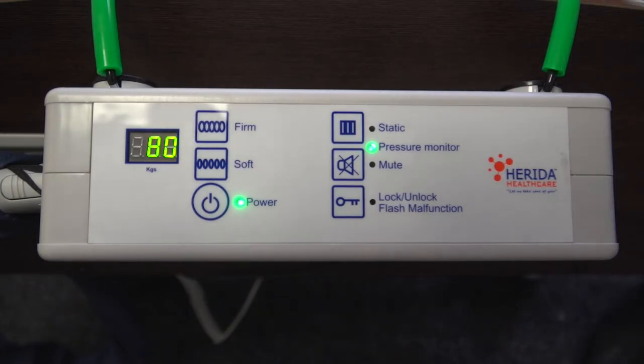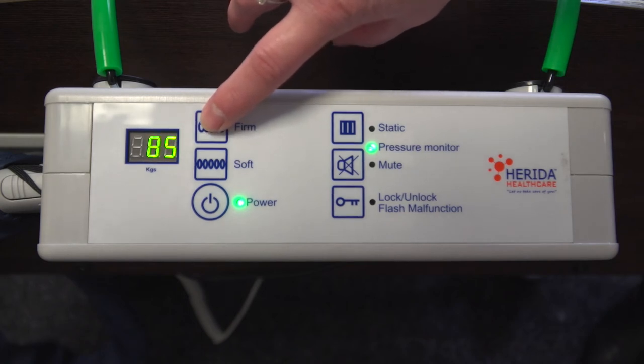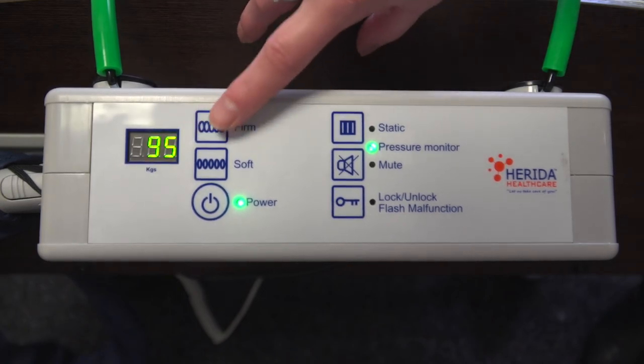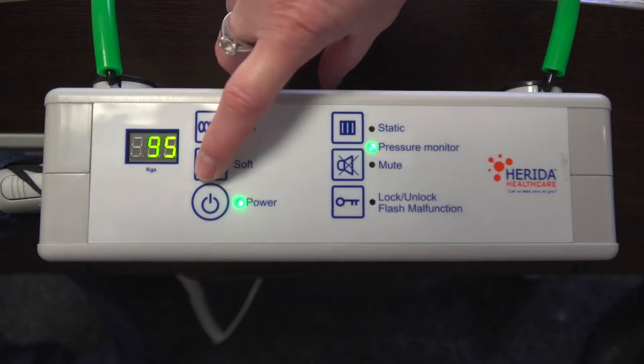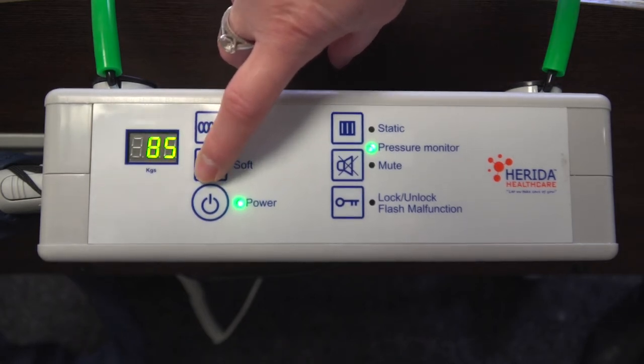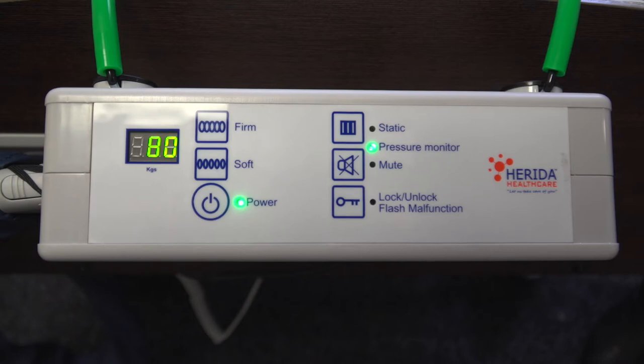If the patient's weight exceeds 80kg, we need to increase the pressure. To do this, we need to use the firm button. Pressing this button once will increase the pressure in increments of 5kg. To reduce the pressure, or if the patient's weight is below 80kg, press the soft button. This will reduce in increments of 5kg. The pump is designed to offer ultra-low pressure delivery for lightweight, frail individuals, including paediatric patients. If the pressure is too firm or insufficient for the patient, the clinician at any time can override the system by using the soft or firm buttons accordingly.